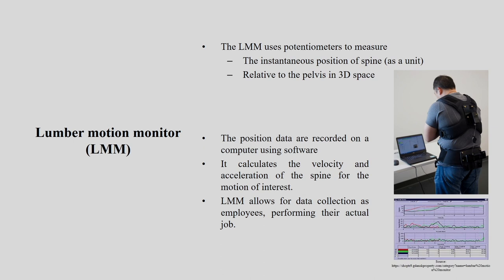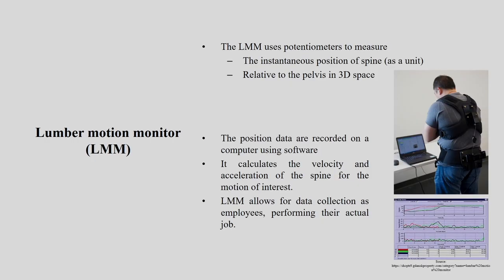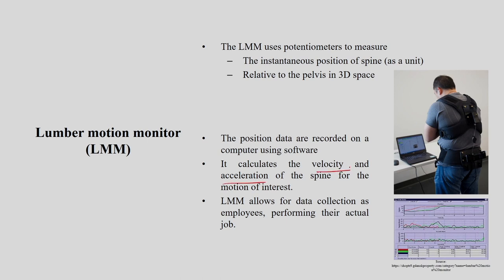The position data are recorded on a computer using software. Of course, it has a hardware component and a software component, so you need to install the software on your laptop and record. It calculates the velocity and acceleration of the spine for the motion of interest. Whichever motion you record, acceleration and velocity will be measured for that motion. LMM also allows data collection while employees are performing their actual job. This is very important: on-field, real-time data collection is possible with LMM.